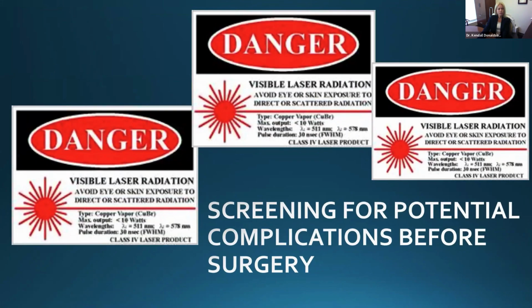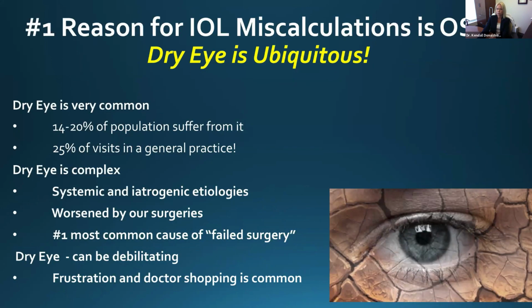So we really need to screen for potential complications before surgery, because any complications seen after surgery or error in IOL calculations seen after surgery is considered our fault, really, or a complication of the surgery, where it may have been a pre-existing condition that could have been missed.